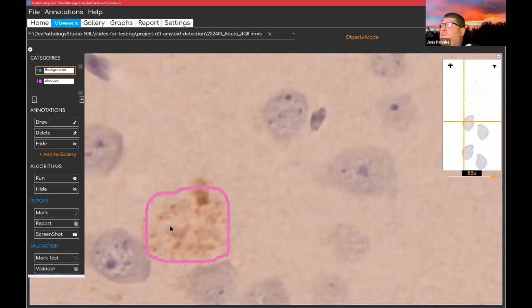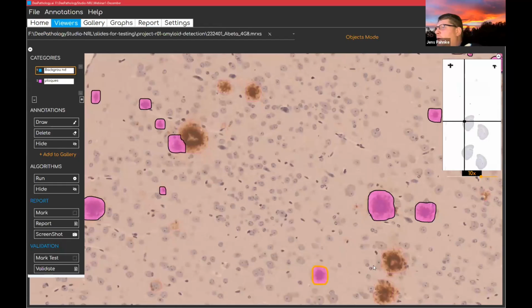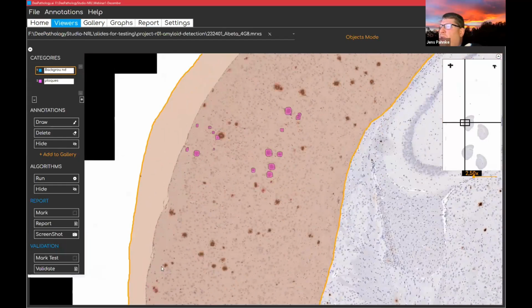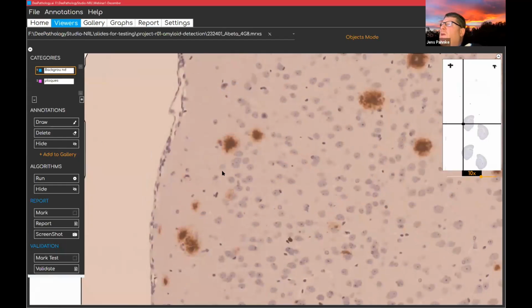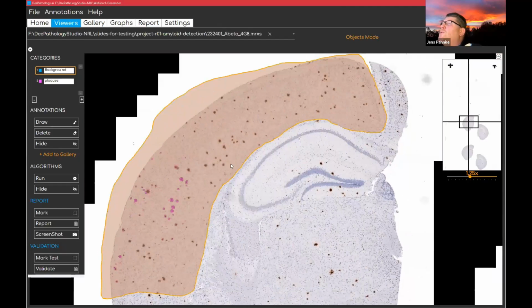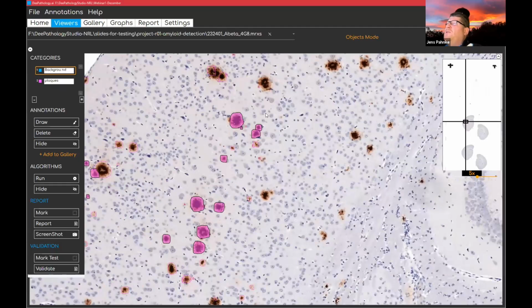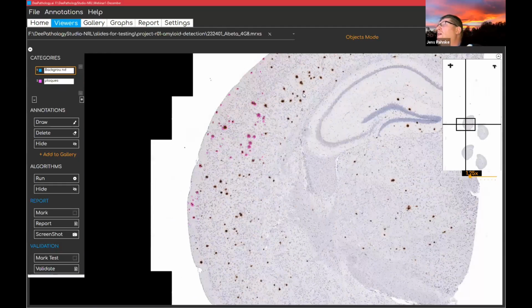Here's the question, do we want to have this or not? It will be detected anyway, and we can go here, here, and here. So that's very easy and very simple. And in a second, we will start the detection again on the slide by choosing a new field, just to have a look here, you see. So that's actually not very complicated.